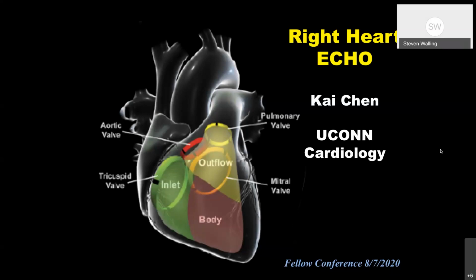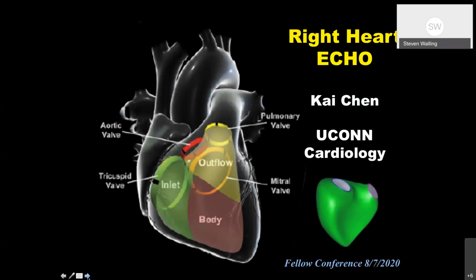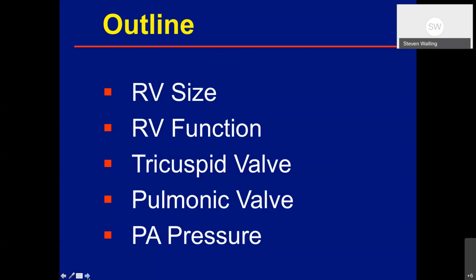So we're going to talk about the right heart echo, and we have a lot of numbers. We have a lot of formulas. So I'm going through those today. It's very basic. Okay, so that's fine. So this is the outline.